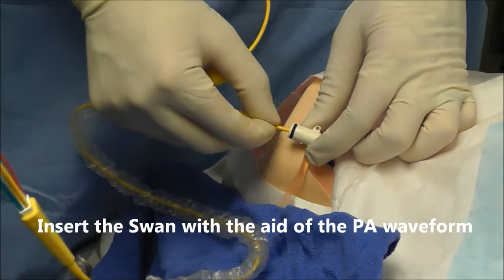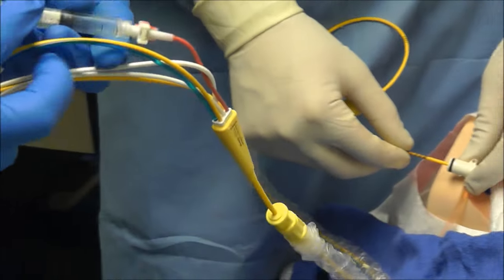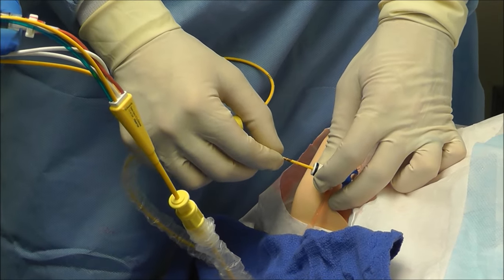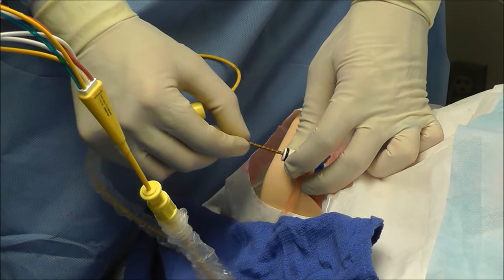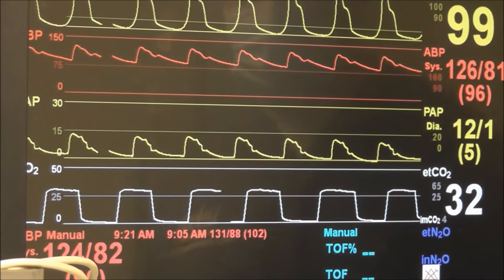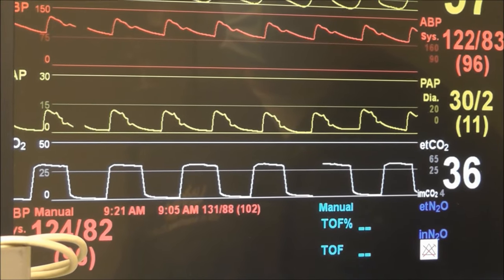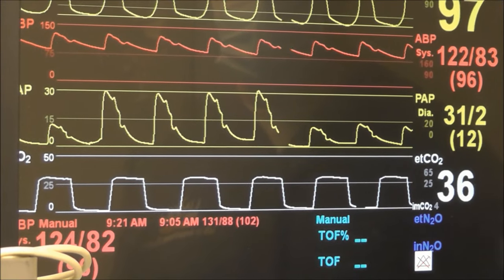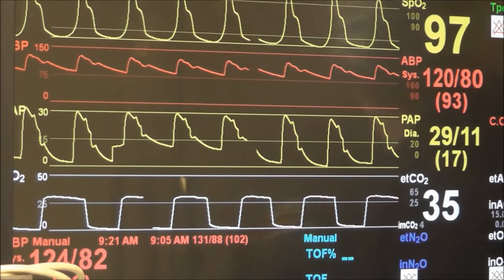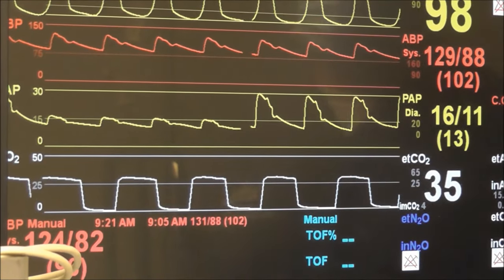We're ready to float this now. Go ahead and inflate the balloon for me. Balloon is now up. We're going to look at our pressure waveform to guide where this is as we advance. Right now you can see we're in the right atrium, so I'm just going to advance here slowly — watch for waveform changes. Looks like I'm in the right ventricle now, so I'm going to keep advancing. That looks like PA because my diastolic pressure went up. And it looks like I've wedged right there — I'm going to stop right there.